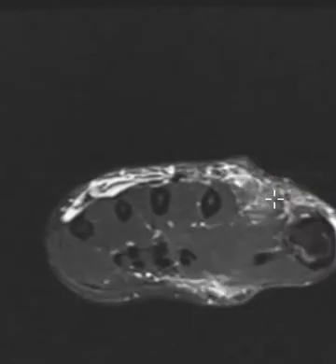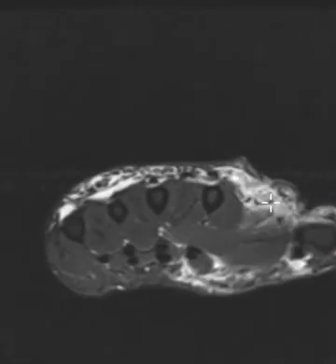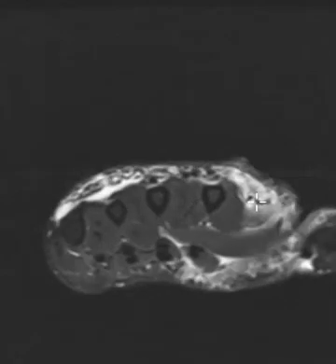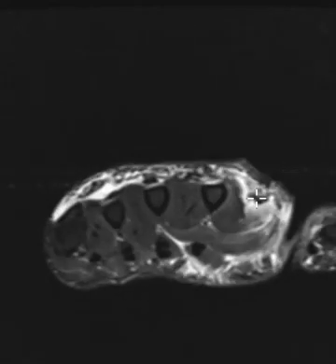This foggy thing here is the muscle. As we follow it up it looks kind of funny — foggy, bright, ill-defined — and then we're going to get into that central tendon here distally. There's a tendon, there's a tendon, and then one more cut and we're out of it. So that's the ruptured, retracted tendon.